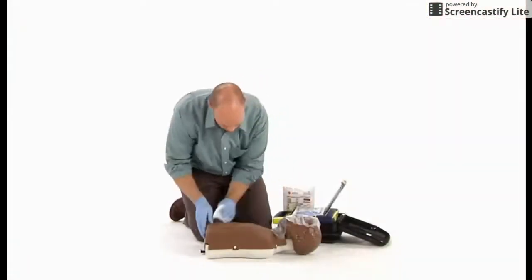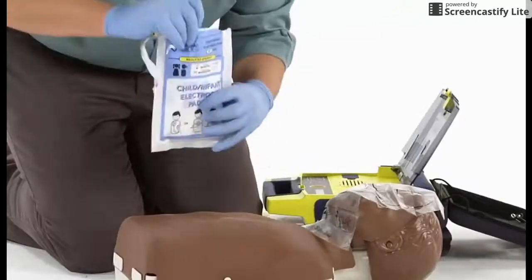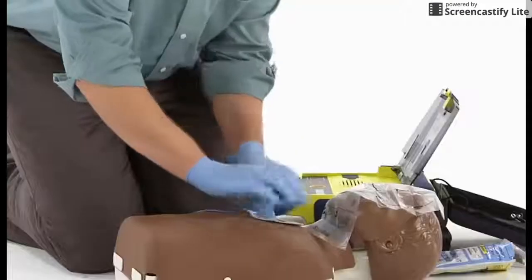An AED can also be used for children and infants who are not breathing. Use pediatric pads if they are available. Operate the AED and apply the pediatric pads to the child's chest the same way you would for an adult.